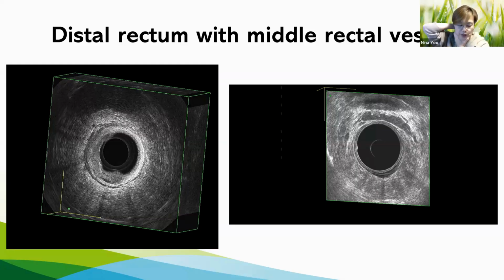Well, summarizing your question, in guideline, transrectal ultrasound can be used to evaluate the rectal cancer, but in conjunction with the MRI. I usually use transrectal ultrasound especially when the patient has a very low distal cancer in the rectum, before surgery, to decide whether to do sphincter preserving surgery or APR, and whether I need to do pelvic exenteration.